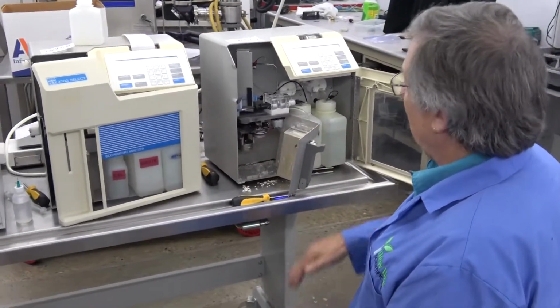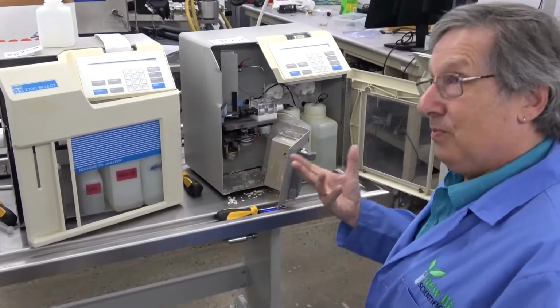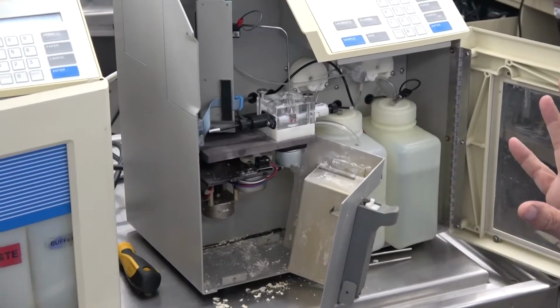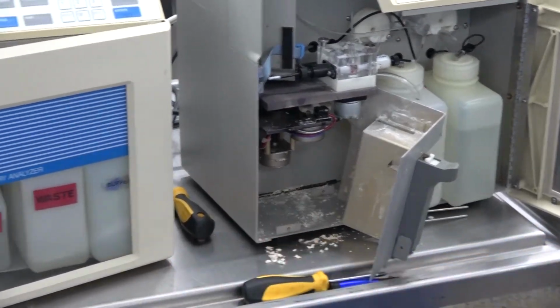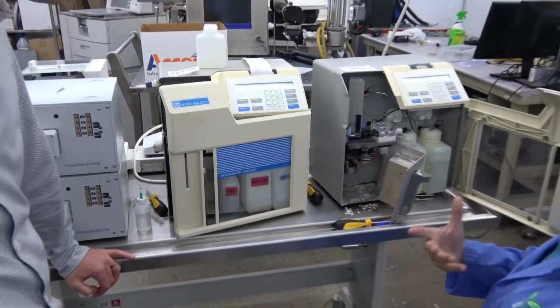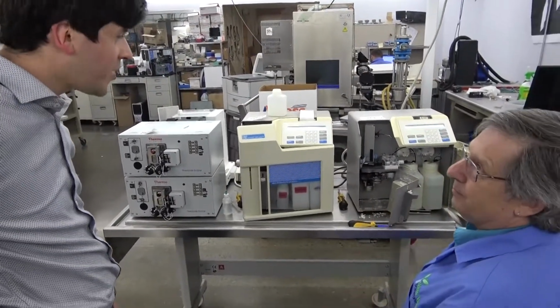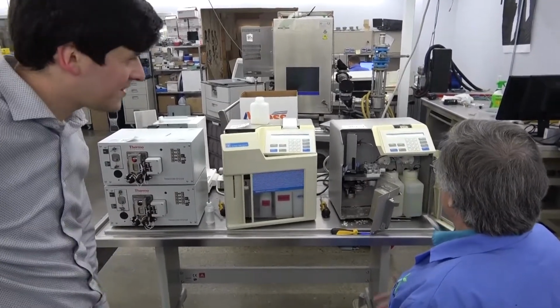And this is one of the things that we do, is take them apart, look for problems, see if they're a fixable problem. If they're not, we dump them as a parts unit. This one actually pumps water just fine, no problem. That's really all they are, a water pumper with a probe, right? They do seem to measure electrical resistance across the fluid. That tells them what you want to know. You're looking for certain analytes, biochemical components.